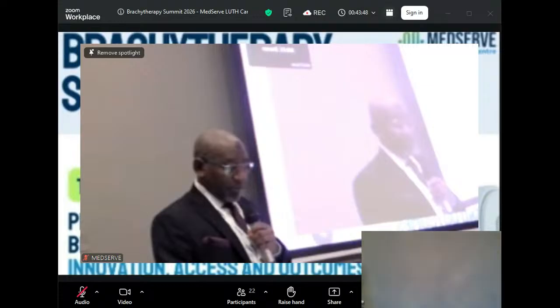There are so many innovations: image-guided adaptive therapy, which has now become standard in cervical cancer management. We have artificial intelligence automation, 3D printing and customized applicators, surface electronic brachytherapy, real-time telemetry and navigation systems, as well as integration of molecular oncology. While those advances are exciting, we must confront painful truths.